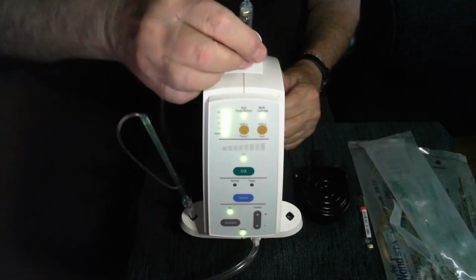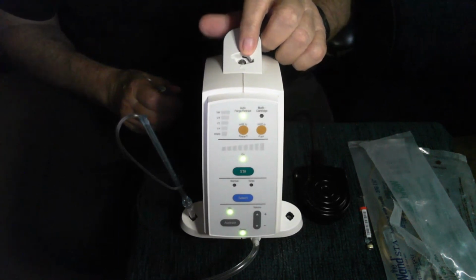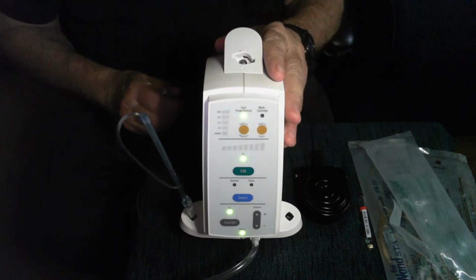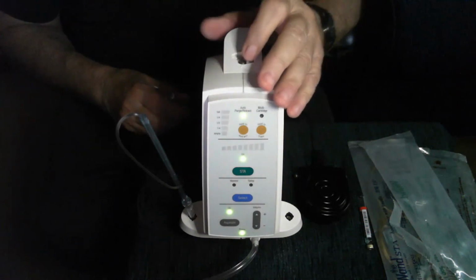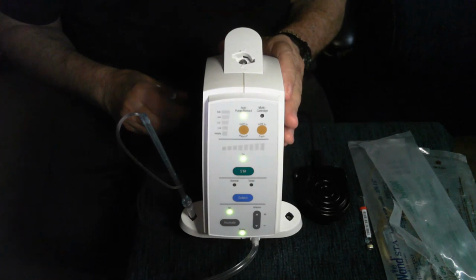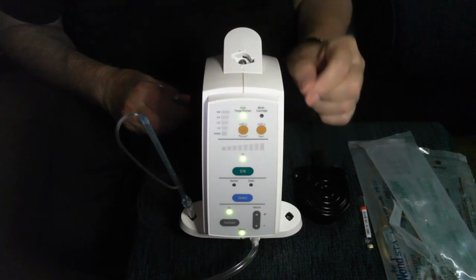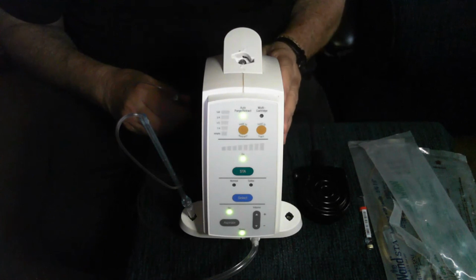There's just one maintenance issue here. There's an O-ring at the top of the plunger you can maybe see, and that needs to be lubricated. Every 25th time you turn the instrument on, the voice may say, check lubrication and O-ring. This is a signal to your dental assistants or your staff to check that this is lubricated properly. We give you one little tube of silicone gel with every box of handpieces that you buy, and that is what you should use to lubricate this, probably every 2-3 weeks, something like that.